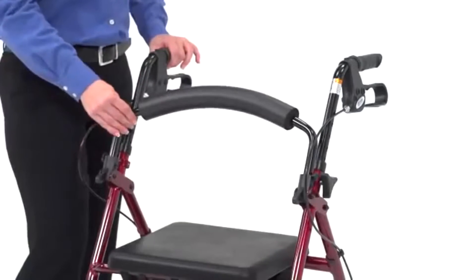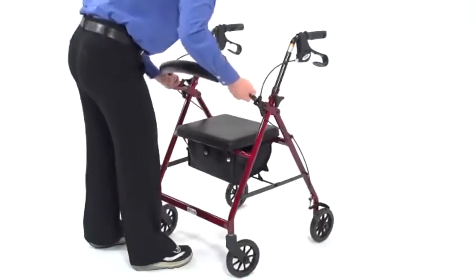The backrest folds up or down for easy storage and can be removed as needed.